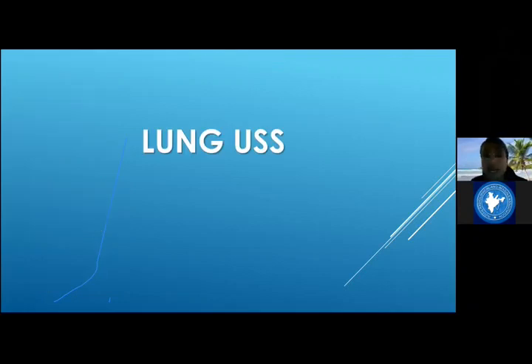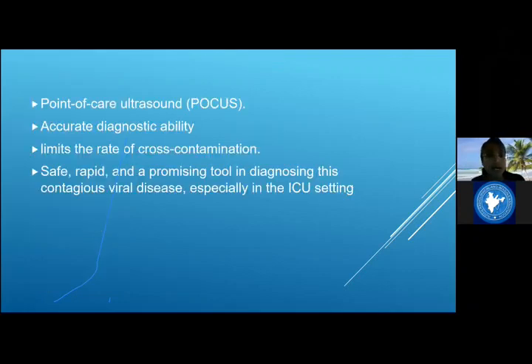So now coming to the last part, that is the lung ultrasound part, we call it point of care ultrasound, or POCUS. I don't know how many of us are doing it. There is actually a controversy in many hospitals, even in AIIMS, the intensivists are doing the point of care ultrasound. But here in Gokulam Medical College, Vishak sir is doing it, and he has trained all the radiologists and the PGs there to do the POCUS. So that controversy is still running, but for completeness' sake, and at least in this COVID era, we should all know about POCUS and how to do it.